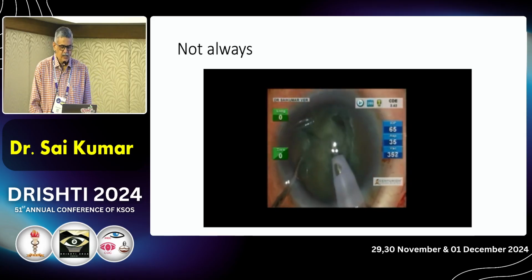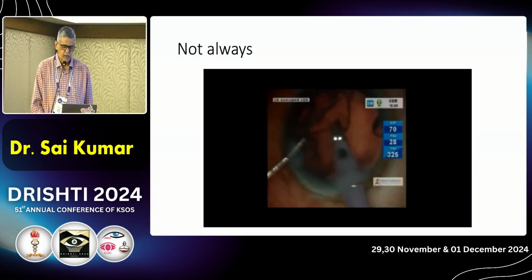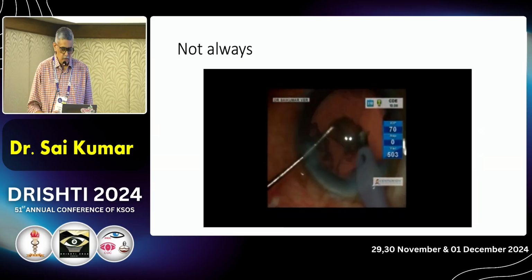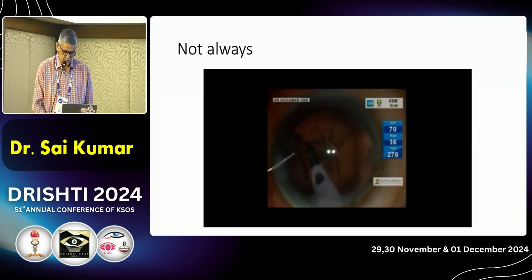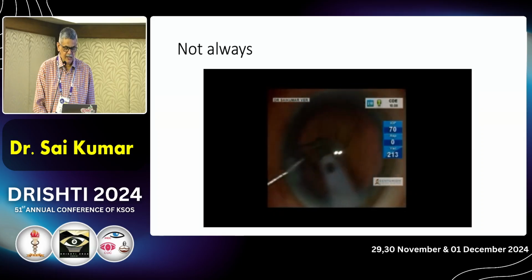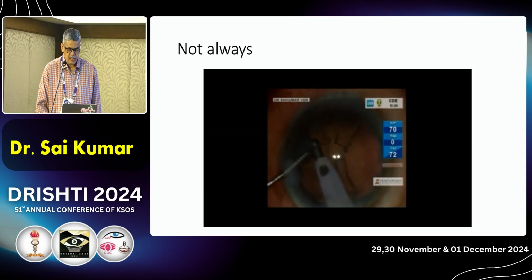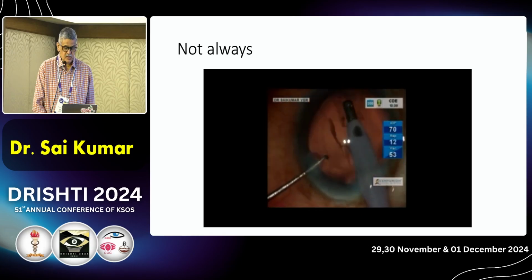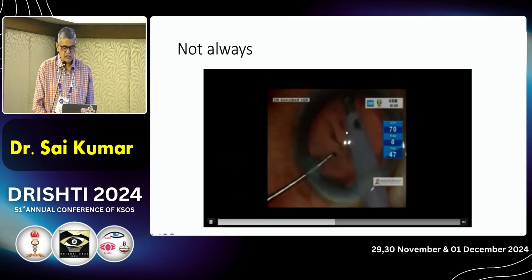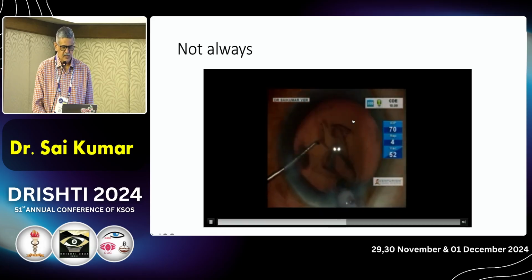And then without any rotation, I chop small pieces and then mechanically move the nucleus into the center, into the phaco probe from various sides and finish it. But as I am finishing here, as I am doing my coaxial irrigation aspiration, I find that there is a PC rent there. So this is the typical, like Dr. Sandhya showed, this is the typical PC rent that you get in a PPC, a long linear PC rent there.